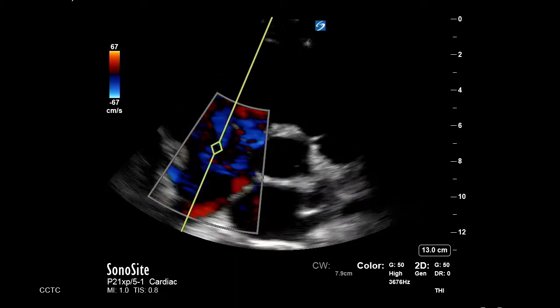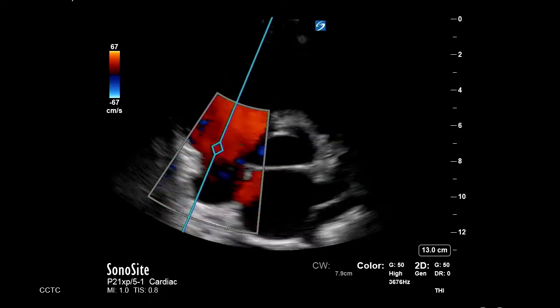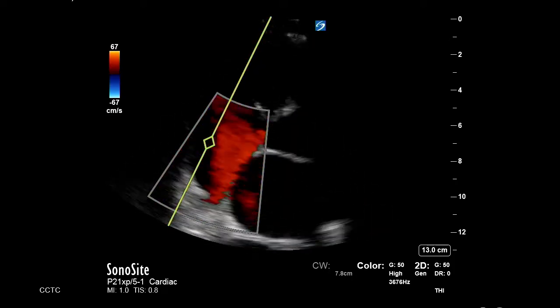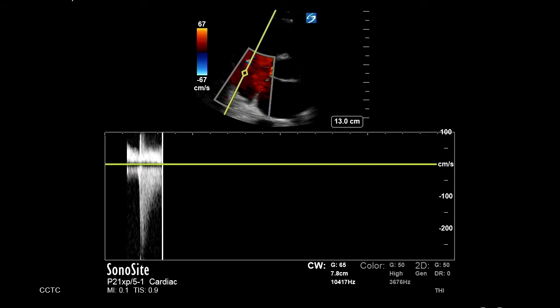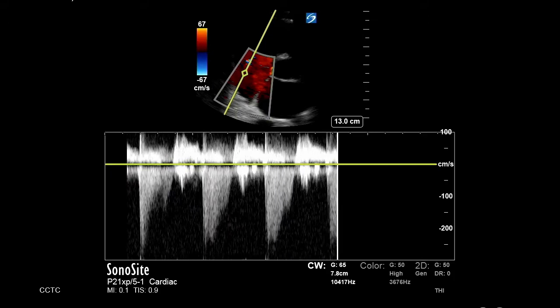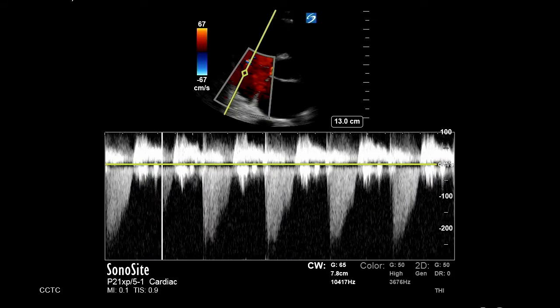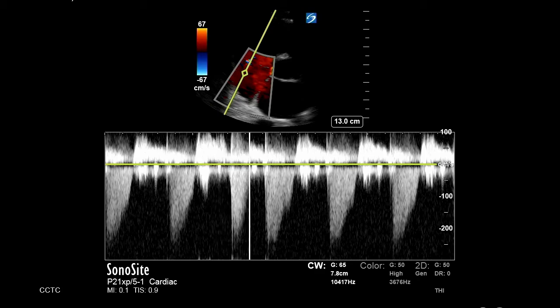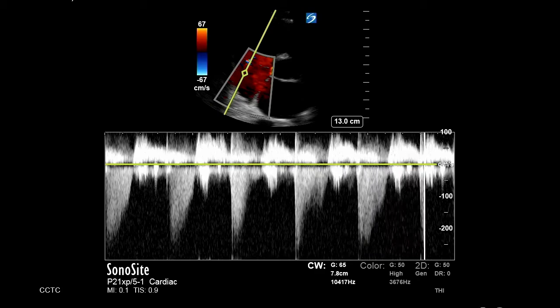Next, select your continuous wave and place it parallel to the flow of the regurgitant jet identified with the color. Hit continuous wave again and a waveform appears at the bottom of the screen. While on this view, small maneuvers of the probe can improve the shape of your waveform.